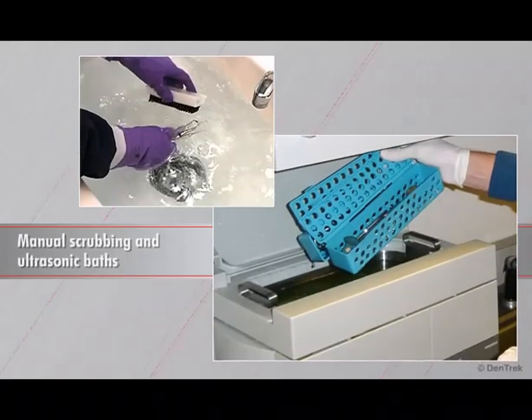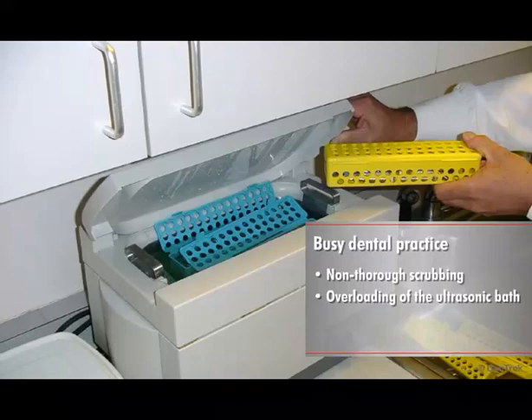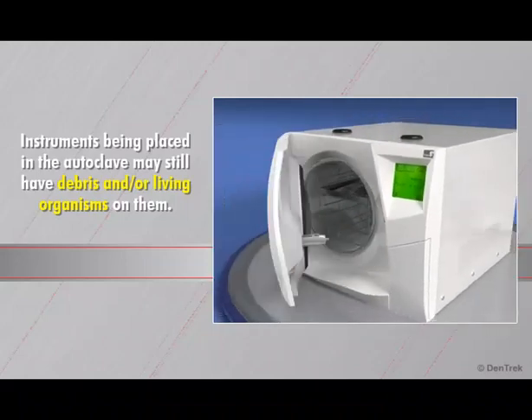The problem with manual scrubbing and ultrasonic baths is that both methods are prone to human error and do not consistently achieve high levels of disinfection. In busy dental practices, assistants are under constant pressure to supply sterile instruments to each operatory. In their hurry to keep up, assistants may not scrub thoroughly, may overload the ultrasonic bath, or even remove instruments from the bath too soon. This can result in instruments being placed in the autoclave that still have debris and living organisms on them.